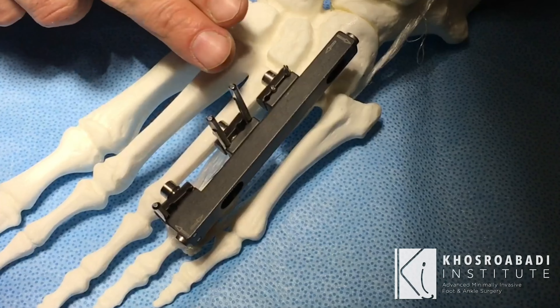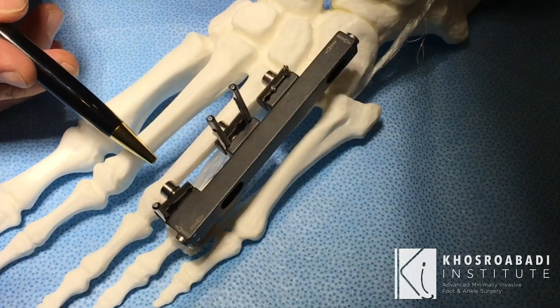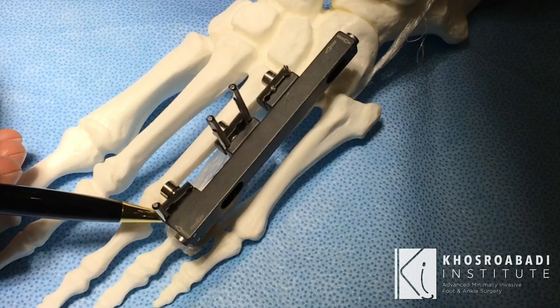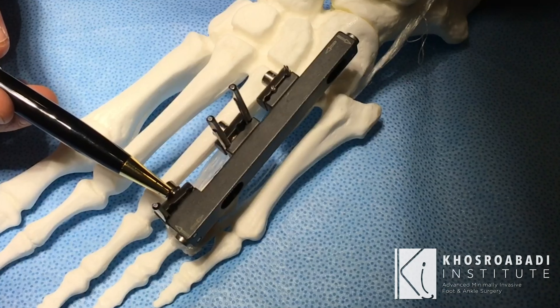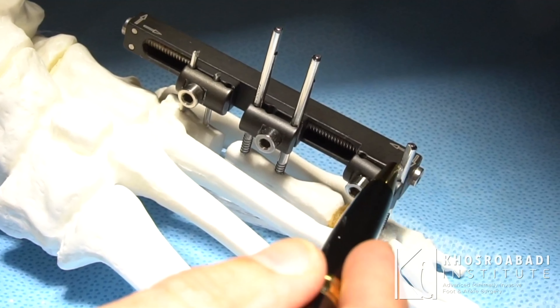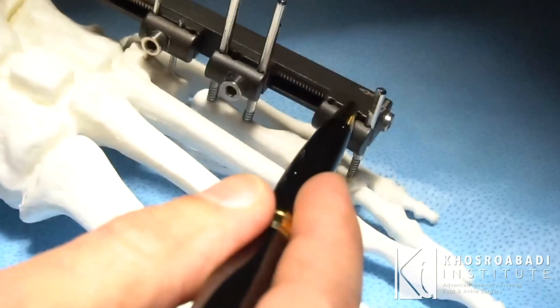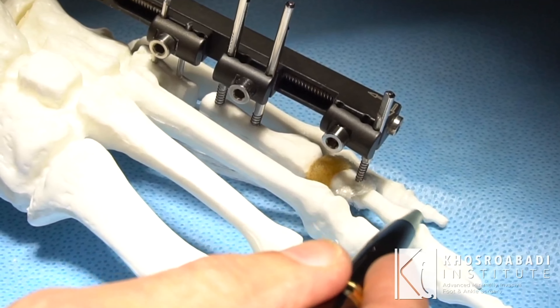The metatarsal is short, so we cut the bone in this segment and start separating it so the bone gets lengthened. The new construct also features a third sandwich clamp, which has two pins — for this video just one pin is shown — that go into the toe itself.